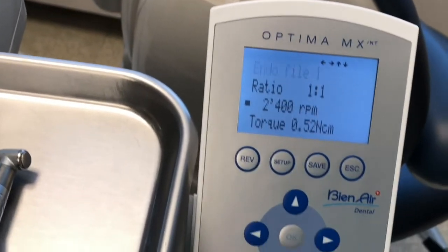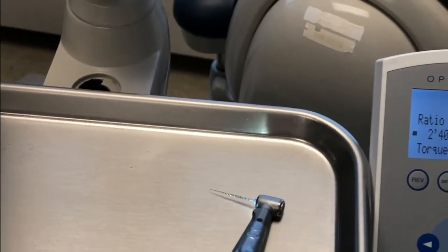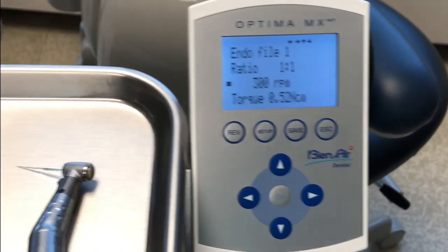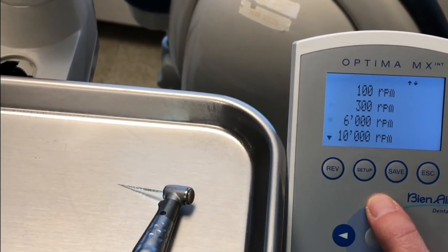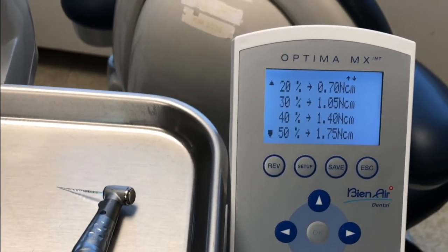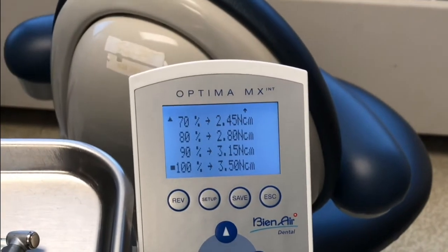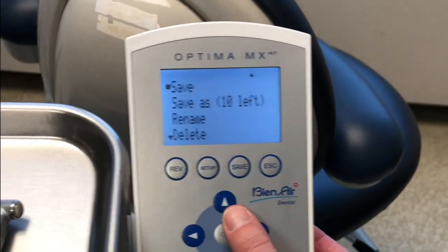Now the RPMs is definitely too high, so we're going to change the RPMs down — go in and find something closer to 300. Then your torque: for the 1-to-1, it's going to be a percentage. The maximum you can have is 3.5 Newton centimeters with this percentage for the handpiece. So you're going to select 100%, then hit save and hit okay.